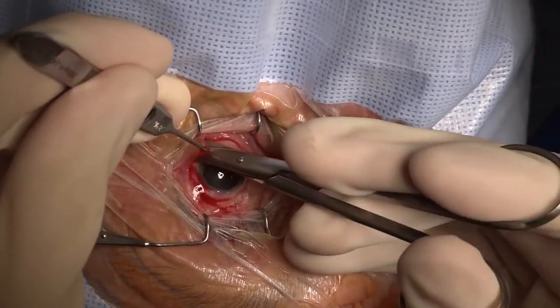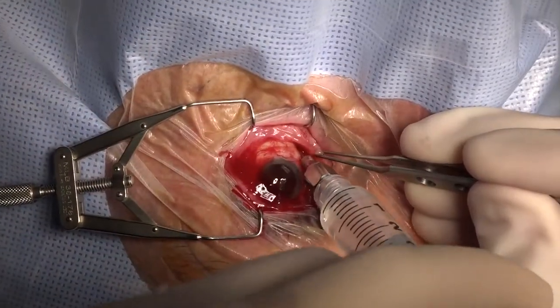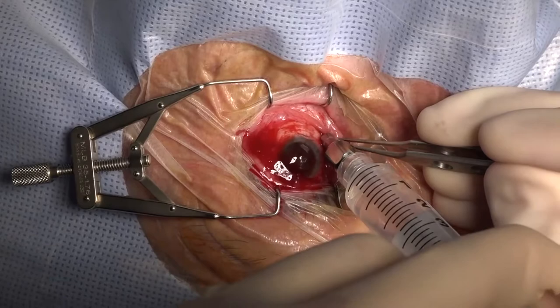After this, the quadrants are dissected using a Stevens tenotomy scissor, and a sub-Tenons block is given using a blunt cannula.